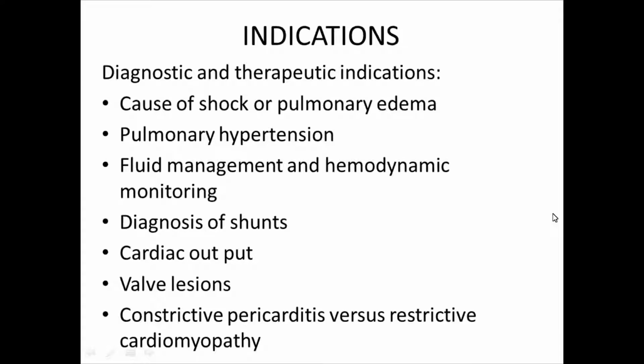Again, differentiating constrictive pericarditis from restrictive cardiomyopathy is one of the main indications for invasive hemodynamics. There are a lot of indications. Among them, these seem the most common indications for hemodynamics.